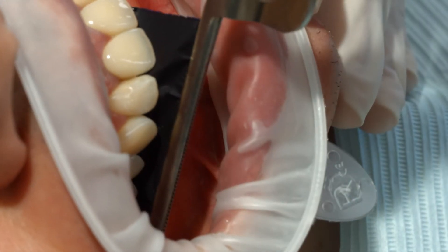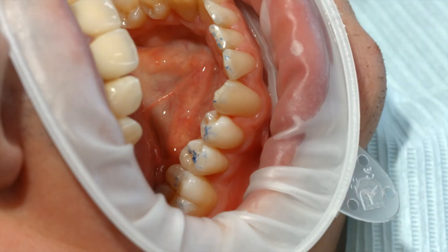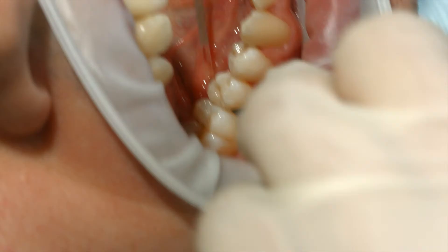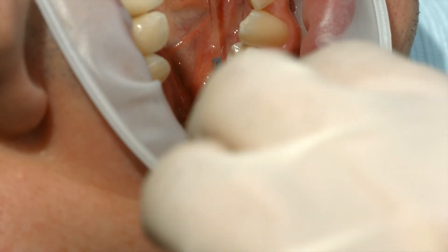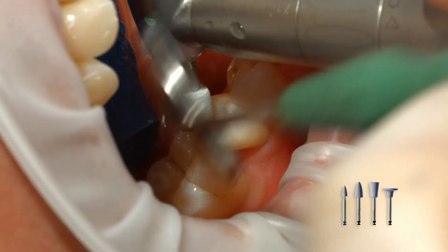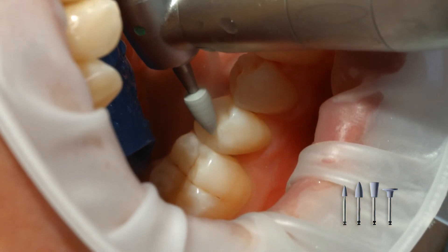After having removed the rubber dam, check the occlusion and functional movements and make adjustments if necessary. Finish the proximal surfaces using finishing and polishing strips. Polish the restoration margins with polishers, such as Astropole, or with discs.